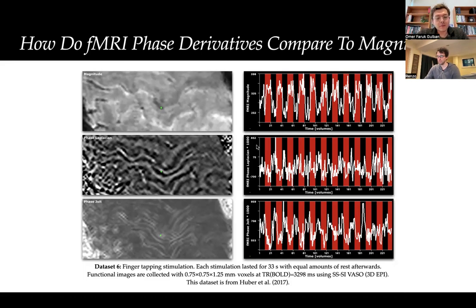Yeah, I didn't talk about it, but here I am using the smallest kernel, which is basically a one-jump or face-to-face neighborhood of voxels. To compute the first derivative, and this is computed in 2D because this is an anisotropic acquisition, you just consider 4 other voxels. And of course, to go to the second spatial derivative, in those neighboring voxels you compute it again. So once you are moving to spatial derivatives, you are integrating information from a larger region, so you are losing a little bit of spatial accuracy, I guess.